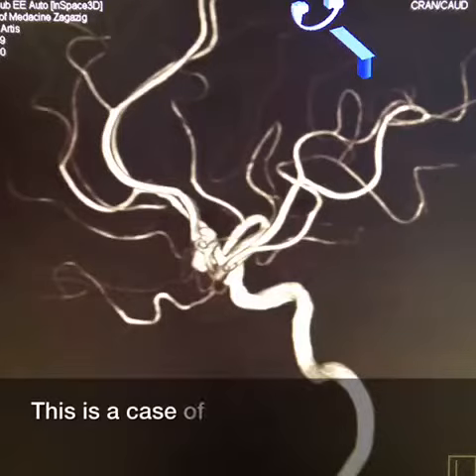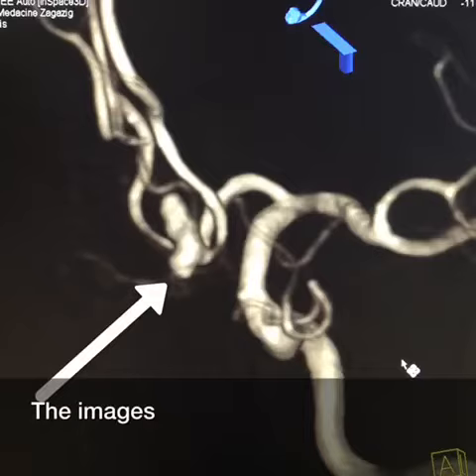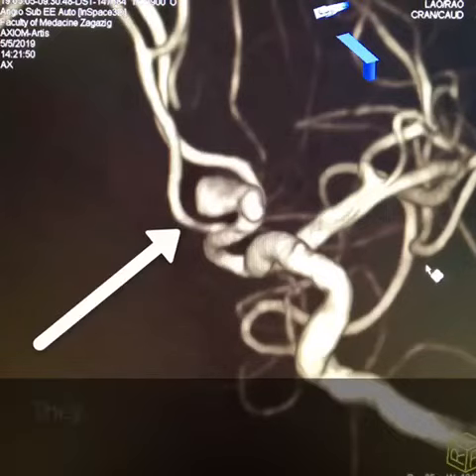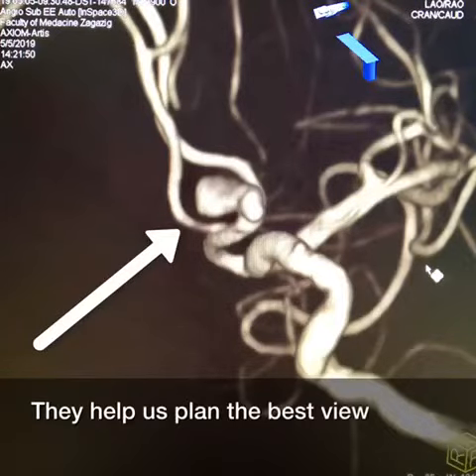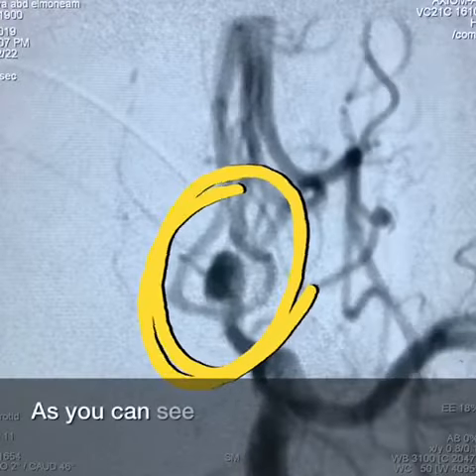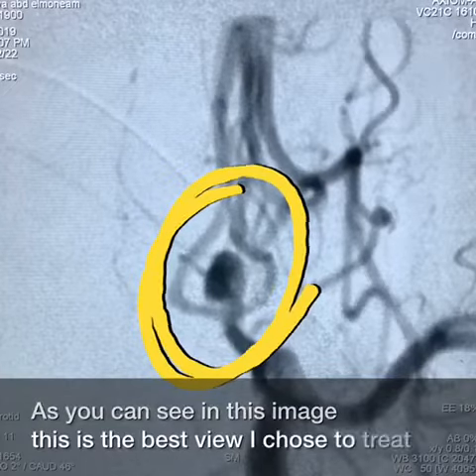This is a case of a ruptured cerebral aneurysm. The images we are observing now are called 3D images. They help us plan the best view we can use to treat this aneurysm. As you can see in this image, this is the best view I chose to treat it.